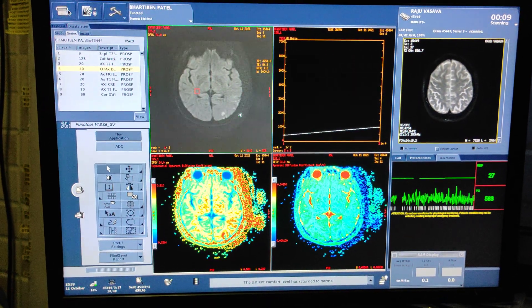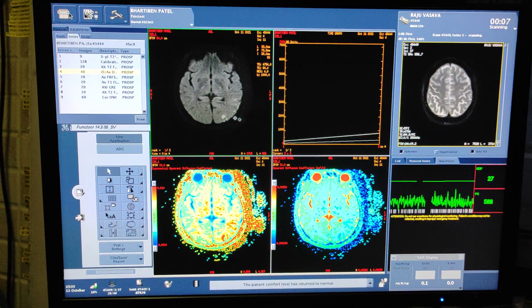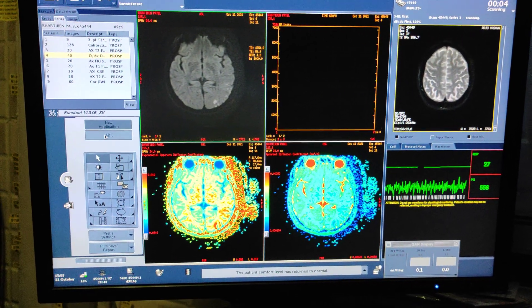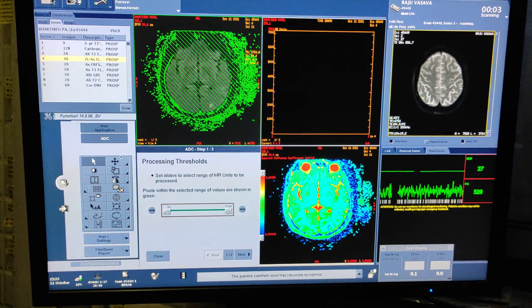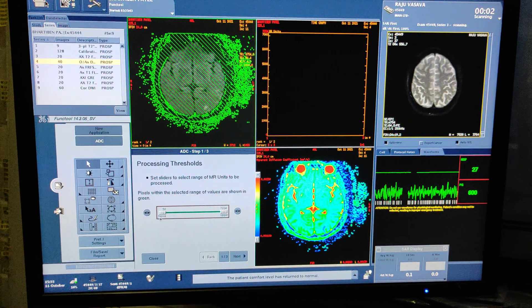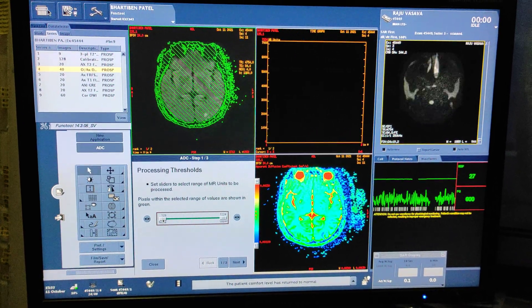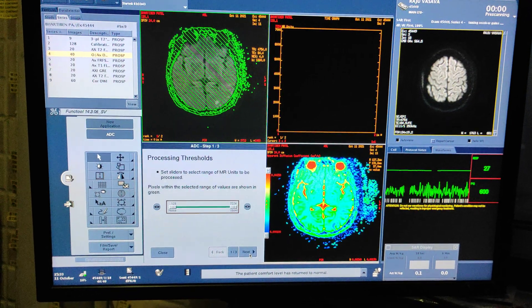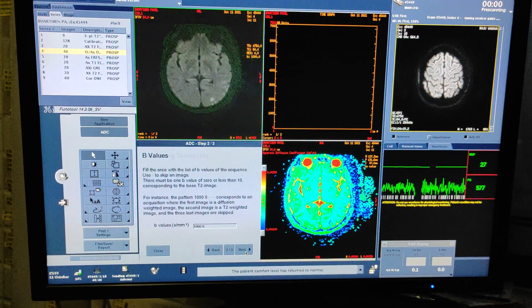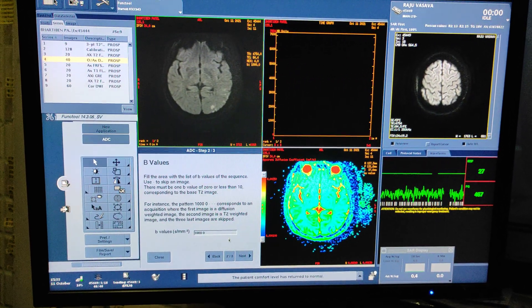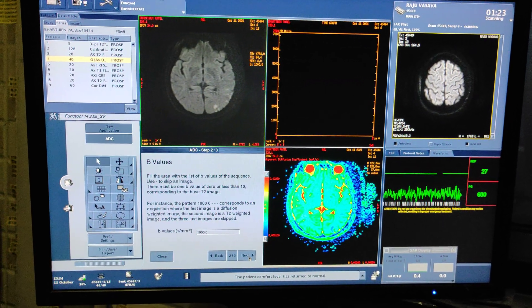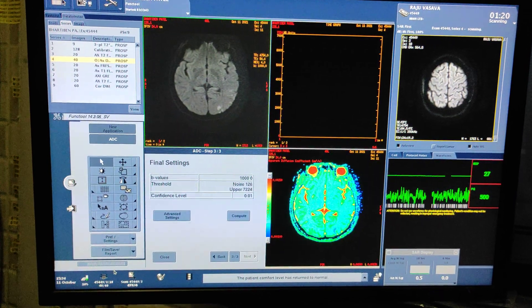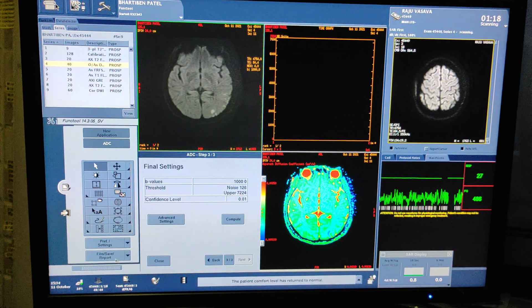It is very easy, you can create it in very few steps. Then after, click on ADC. You have to adjust your noise. Then click on next, set b-value to 1000, then next, then compute.